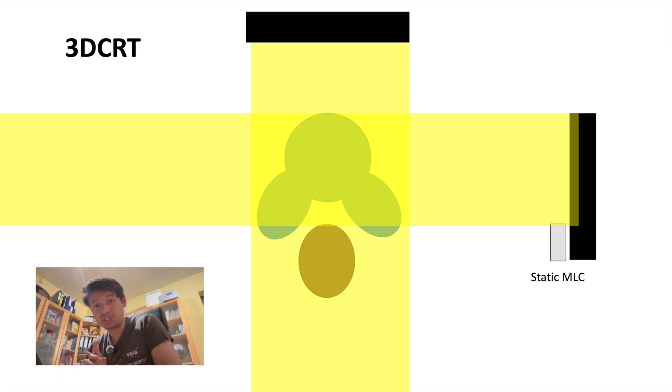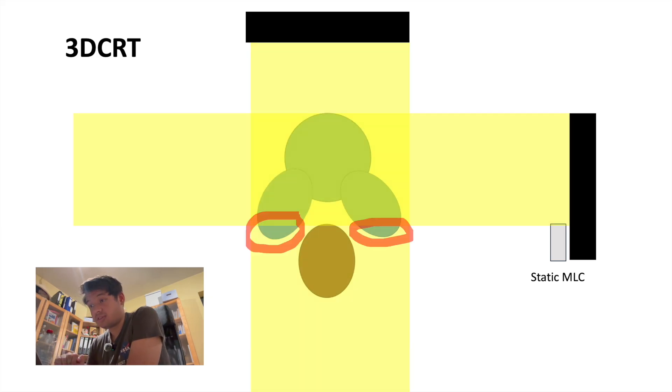In this example, still in 3D CRT, I can spare, thanks to the MLC, I can spare part of the rectum with the static MLC, but the downside is that the seminal vesicles are left uncovered.